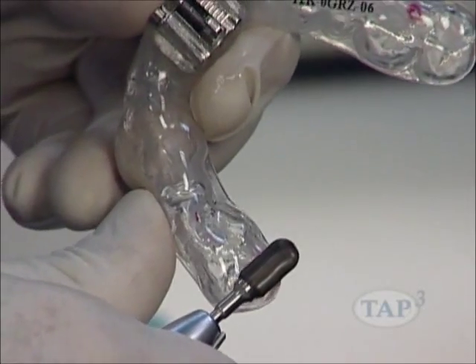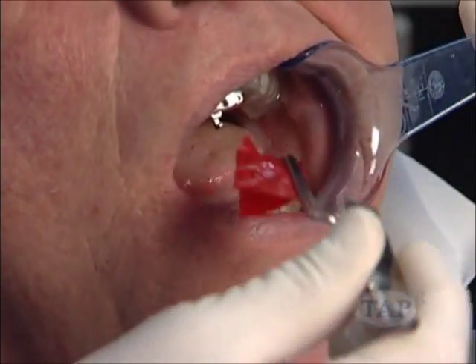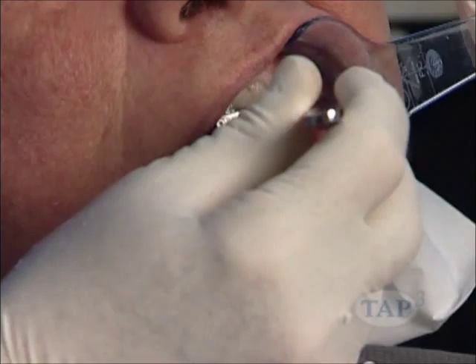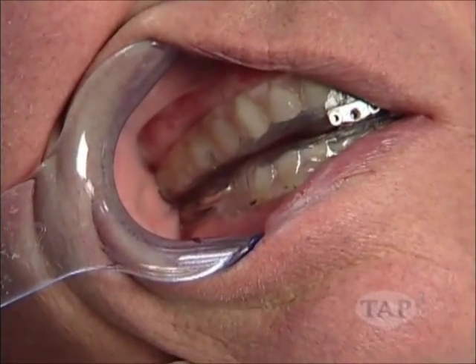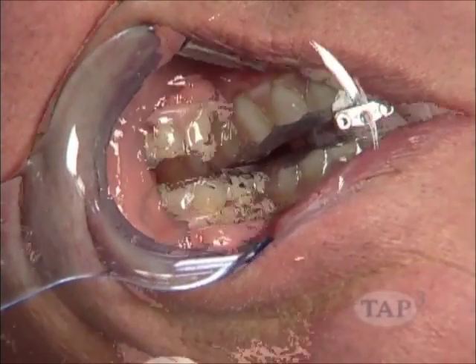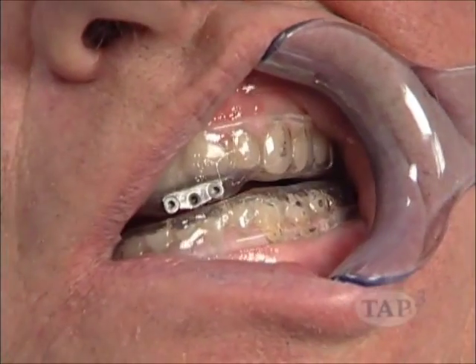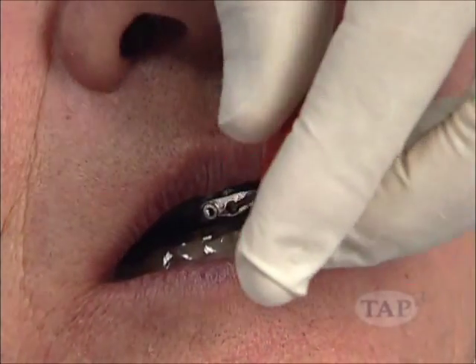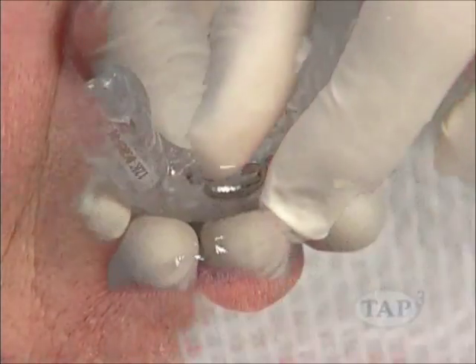Using a burr, remove contacts indicated by the ribbon. Repeat this process until all contacts are removed. Once any posterior interference is removed, check for clearance on both sides of the trays. Any adjustment protrusively will further open the posterior.